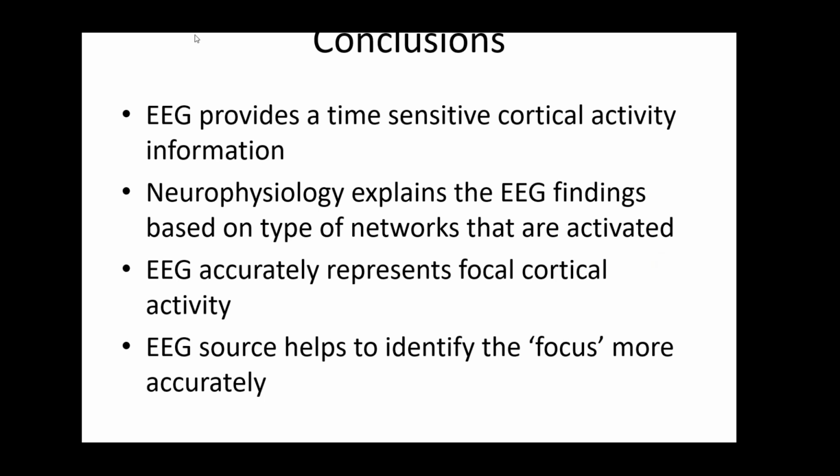Also, you can see the propensity of a network or local focal cortical area to be induced into epileptic activity. When you do, for example, a stereo EEG and you stimulate, and you could have a seizure even with as small a stimulus, it means that this area's threshold for seizures is low. So you sort of test the threshold of these areas by response to stimulation.